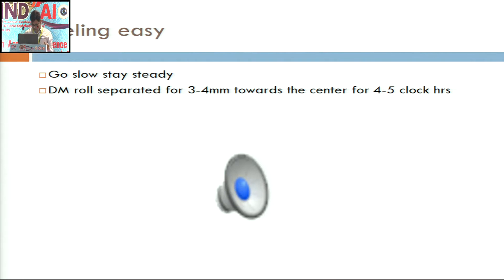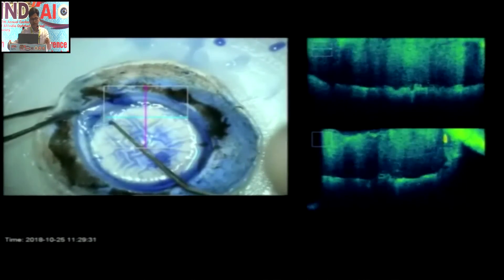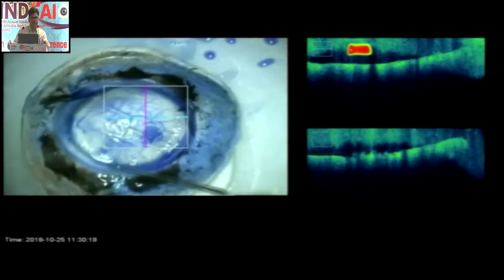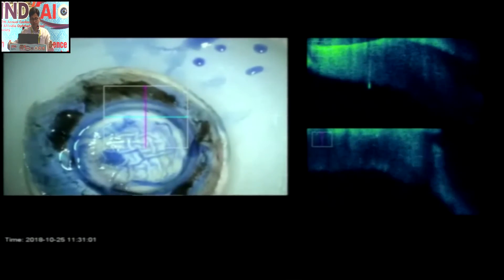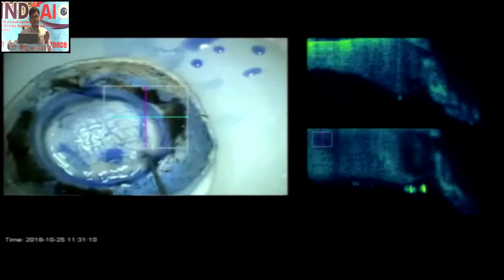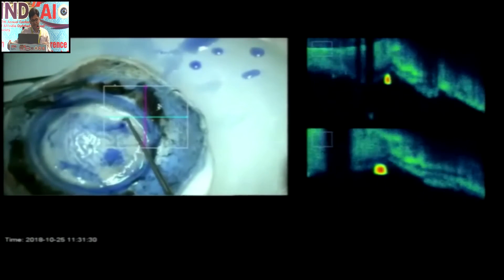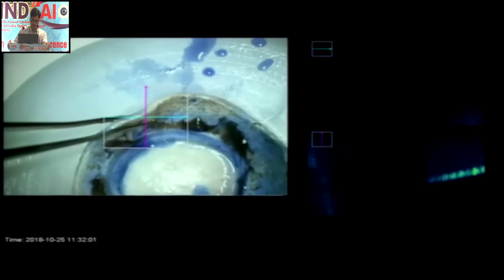This is the video of one of our cases. After partial trephination, you will have to create a 360-degree frill — this is the ring sign I was talking about. Using the Sinski hook, you can free the Descemet membrane 360 degrees all around. One important point to remember is to go slow and steady. If you apply too much force, Newton's third law will come into play and there will be the same amount of traction at the stroma-DM junction, increasing the chances of tear. You can advance the frill a little bit more at the point where you are going to peel, which makes the surgery easier.